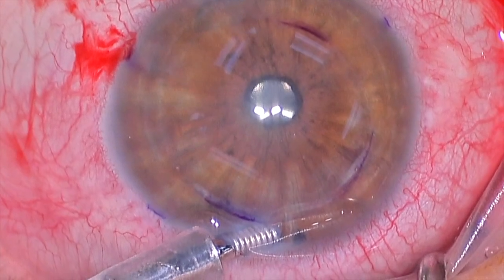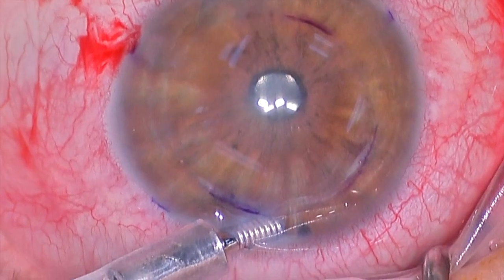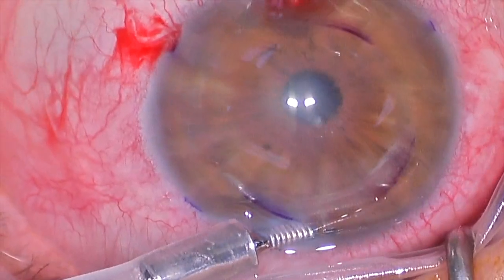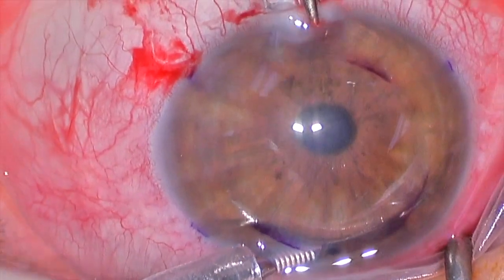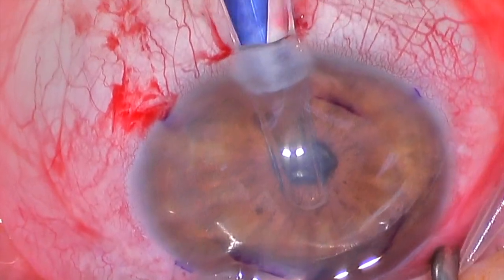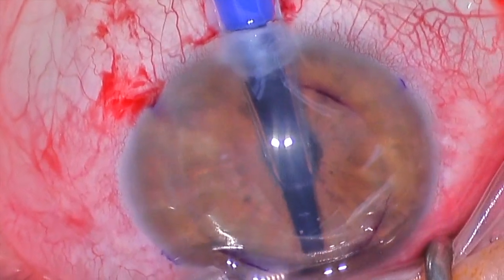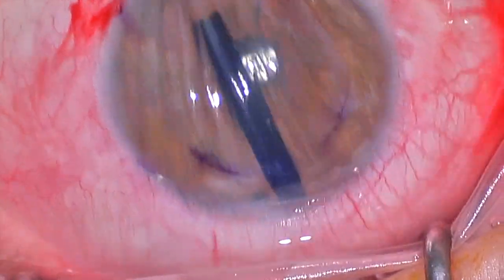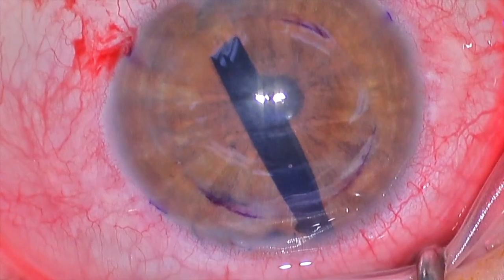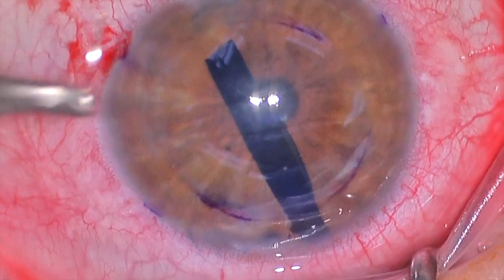There's the injector. We're going to use forceps to lift the mouth of the main incision, and then the scroll of tissue will be placed into the eye. There's the forceps; there's the injector. Now there is the new tissue, stained blue, in a tighter scroll as we mentioned. It's injected into the eye, we take the anterior chamber maintainer out, and we pull out the injector. Now we've got a scroll of fresh, new, healthy tissue in the anterior chamber.